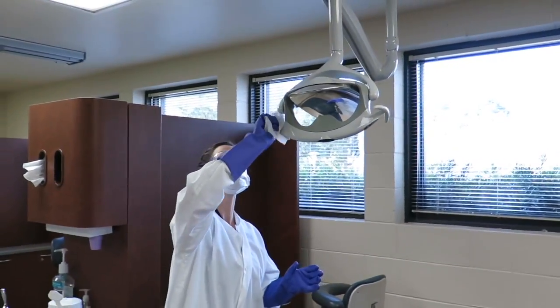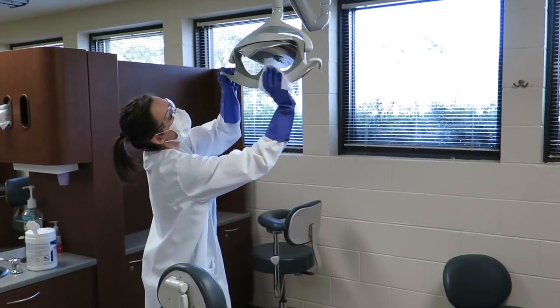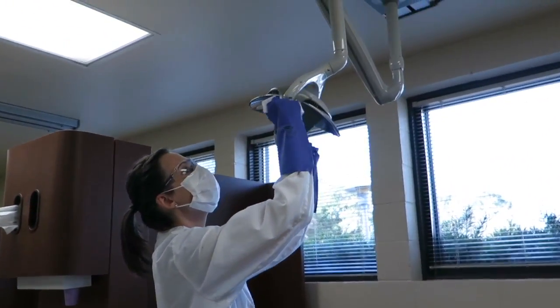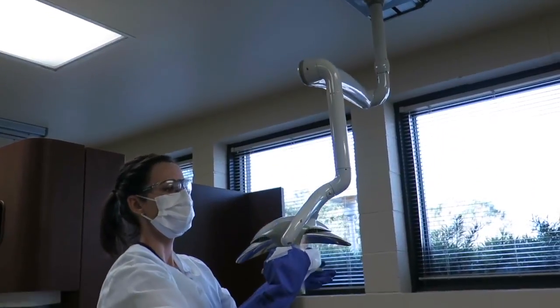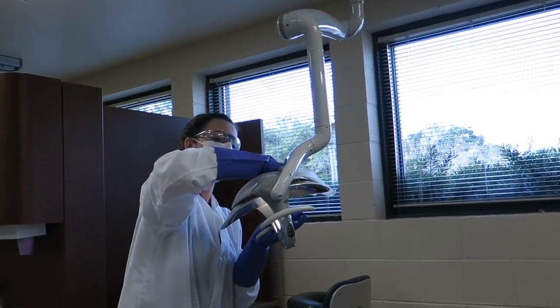Move on to the light, making sure you clean the handles and buttons. But be careful to not clean the shiny metal portion of the light source. You may clean the back surface and up the arm.